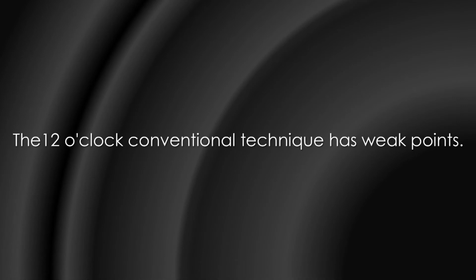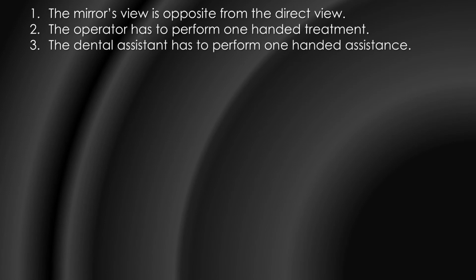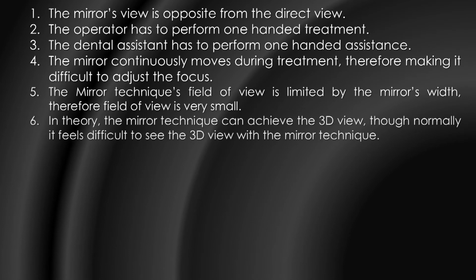Number 1, the mirror's view is opposite from the direct view. Number 2, the operator has to perform one-handed treatment. Number 3, the dental assistant has to perform one-handed assistance. Number 4, the mirror continuously moves during treatment, therefore making it difficult to adjust the focus. Number 5, the mirror technique's field of view is limited by the mirror's width. Therefore, the field of view is very small.